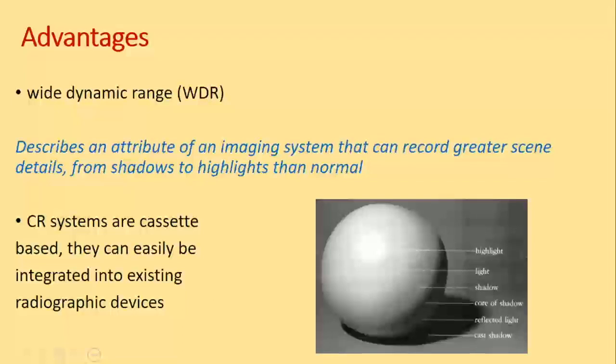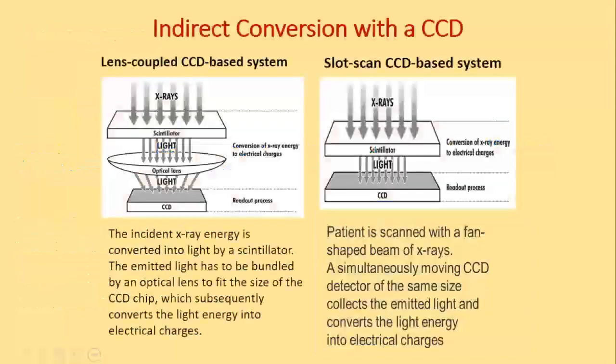But one big problem with CR is noise, radiographic noise. You must have seen PSP systems having a lot of grainy areas. Those typical grains that you see are radiographic noise, and that's one of the characteristics of CR machines. Hence, the need to switch over from CR.